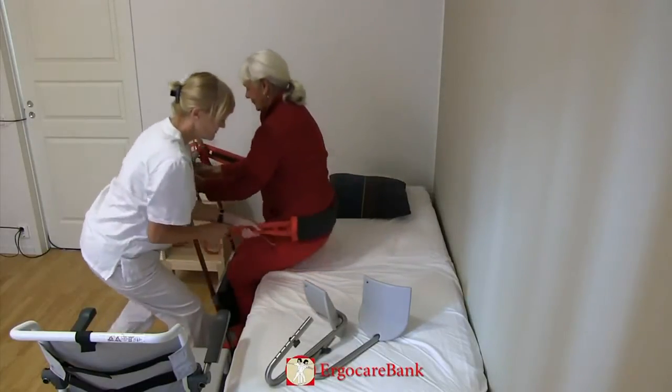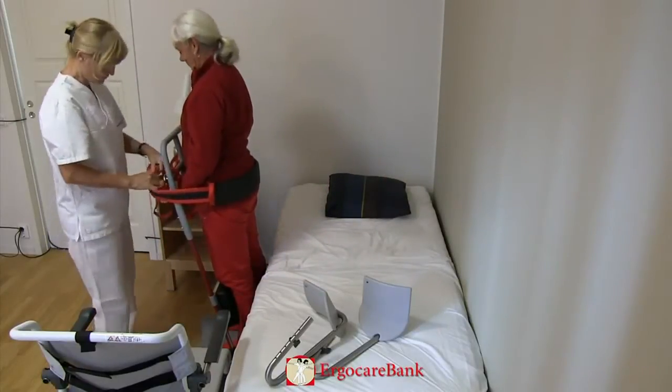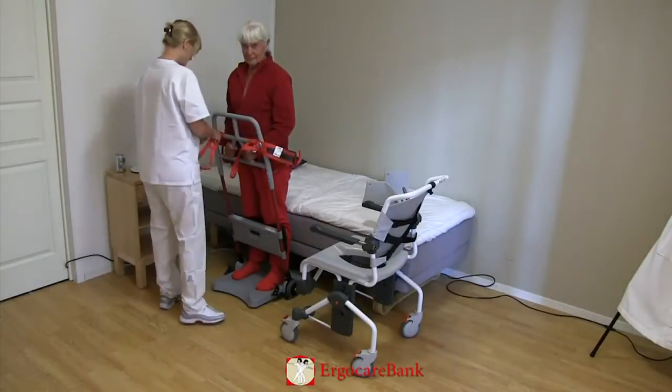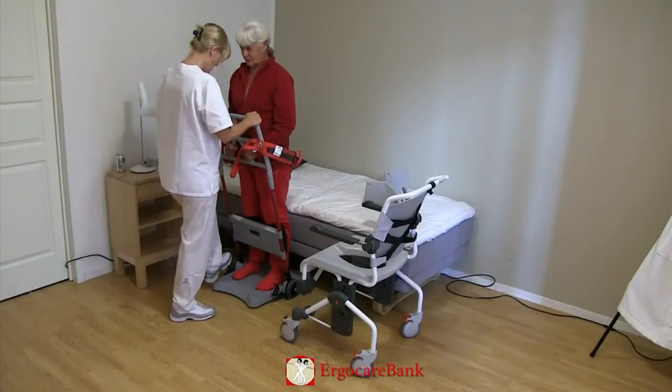Celia, on three you will stand up. One, two, three. The staff member secures the belt to the razor so that Celia is standing secure with her knees locked against the knee rest.